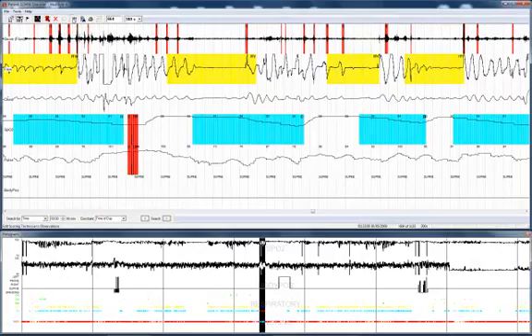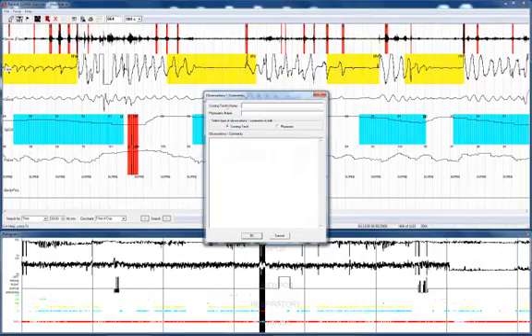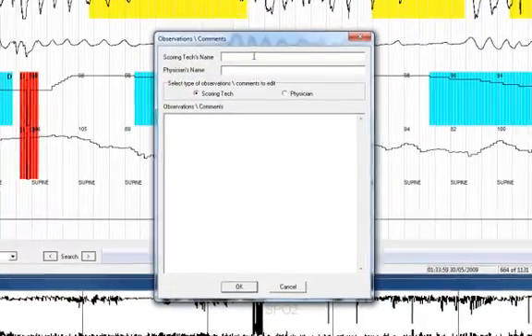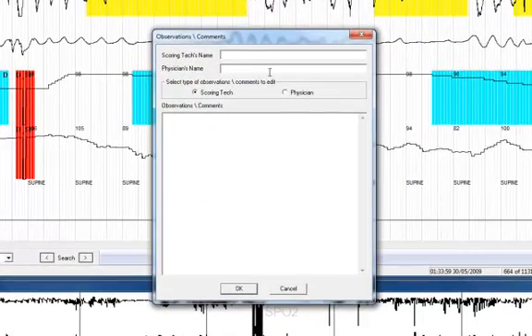The observation screen is where you would enter the scoring technologist name, the physician's name, to enter in observations.